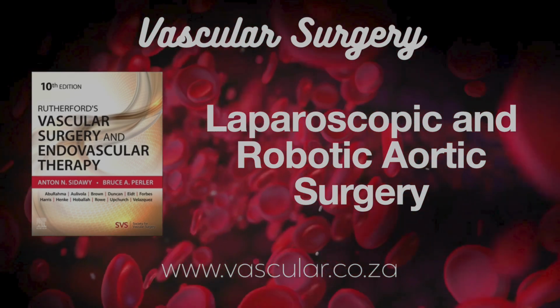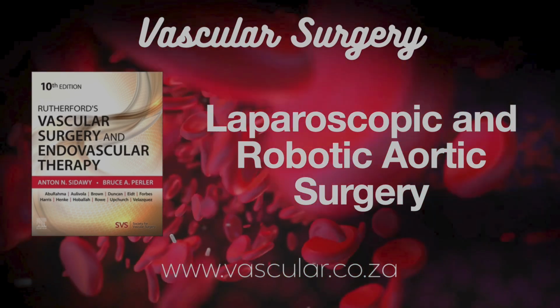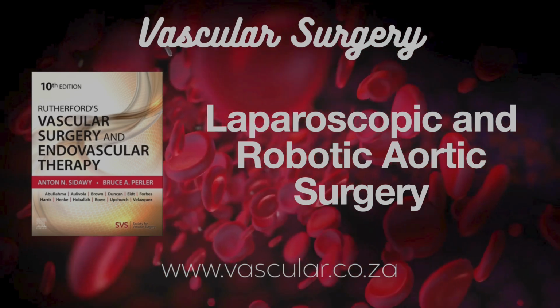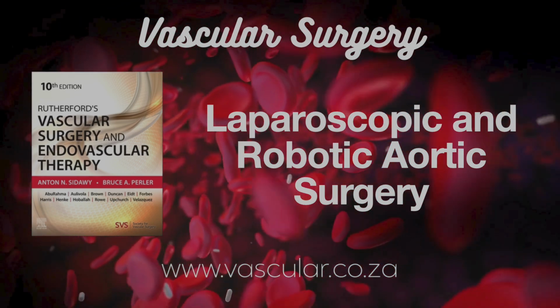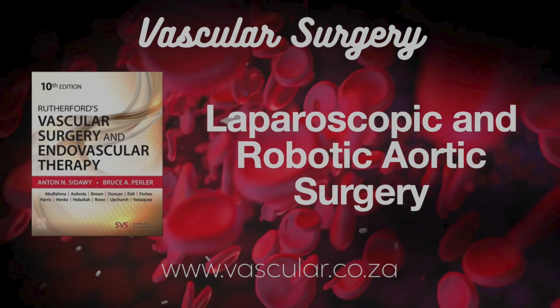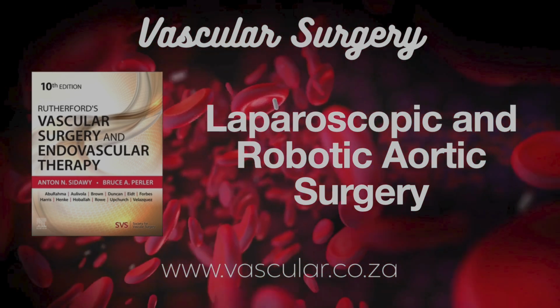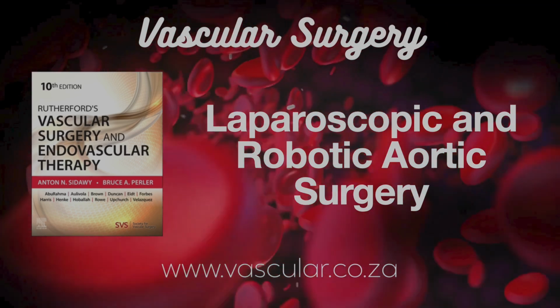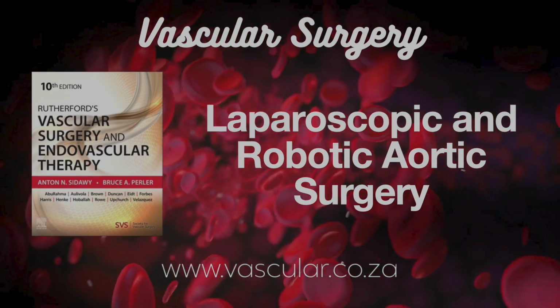Okay, let's shift. Hand-assisted laparoscopic surgery, HALS. How's this different from pure TLAS? HALS is, well, it's a hybrid. You use a special port, a bigger one, that allows the surgeon to stick their non-dominant hand right into the abdomen. While keeping the gas in. Exactly, while maintaining the pneumoperitoneum. So you get the laparoscopic view and the sense of touch.